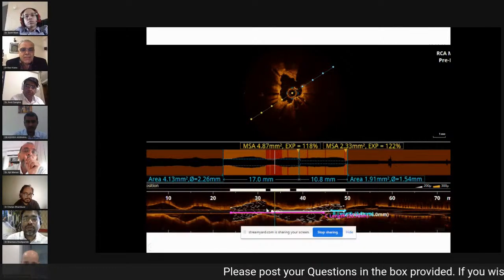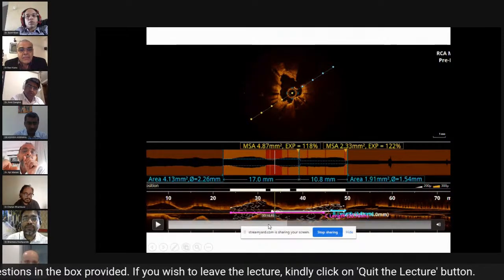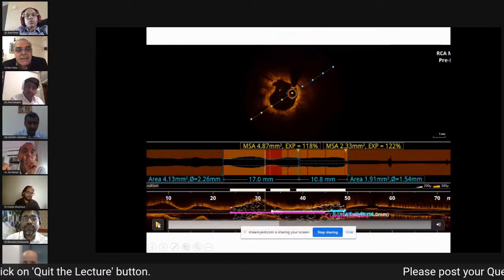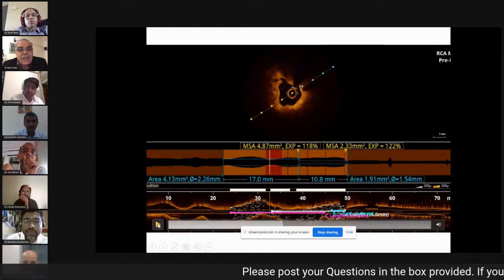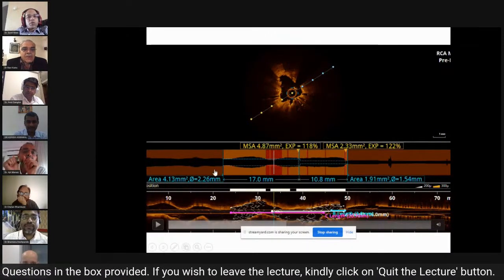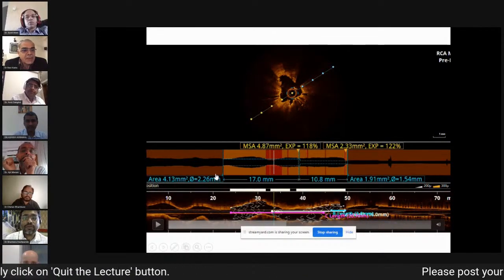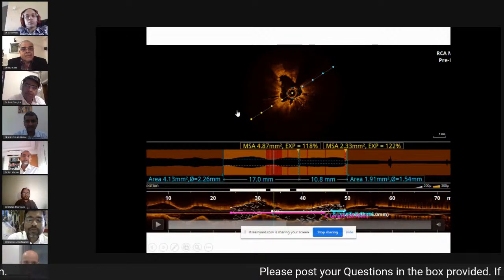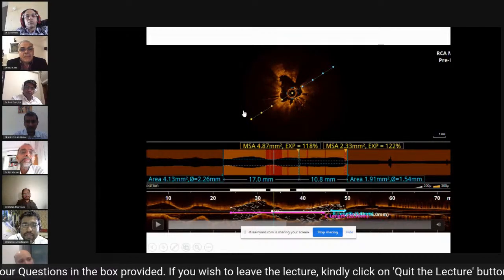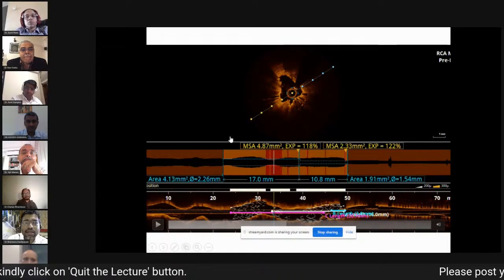Go a little ahead. The stent is not expanded here. There's no stent. No, go ahead. You're going backwards. Here, are you within the stent? This is a little fracture. So it is between the two stents. Yeah, so this is what probably prevented the previous operator from overlapping this segment. Probably there was a geographical miss. The stent would not have gotten to the other stent. I think there is a stent over here. There are two gaps which are seen actually. One gap is here and one gap is here. So whether there was a stent fracture. Go a little ahead.